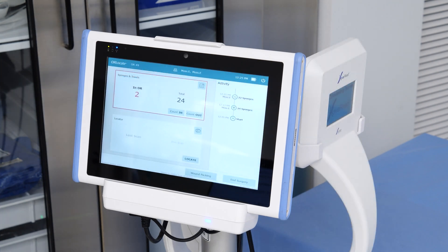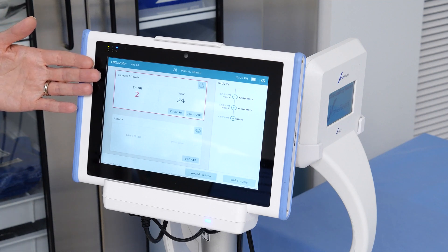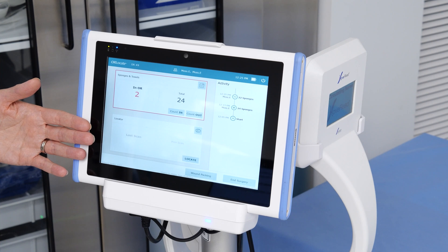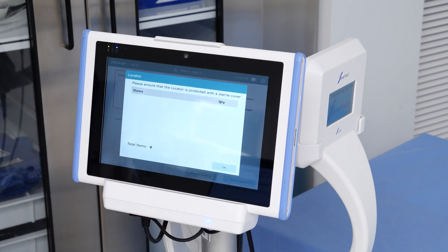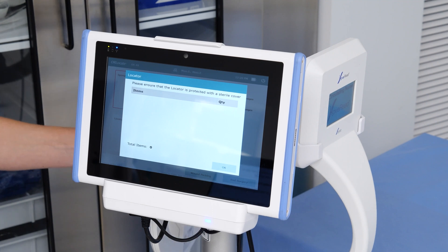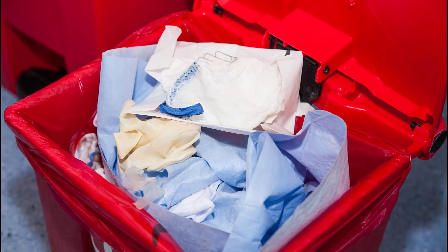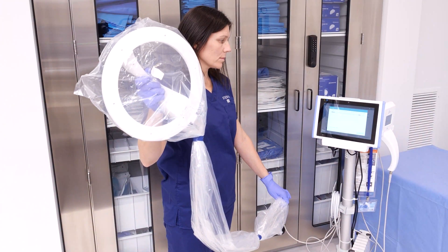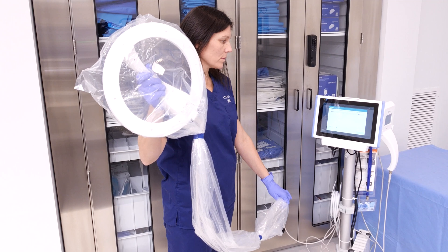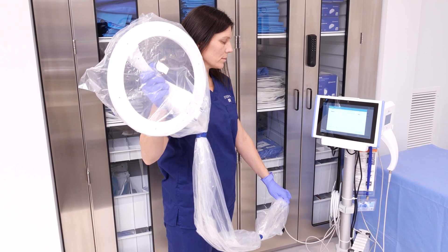In the event that you have a missing sponge, as shown on the screen, the locator will need to be used to determine the location of the missing sponges. Press the locator button in the lower window to turn on the locator wand. Remove the locator and look for the missing sponge by waving over the trash, linens, or patient. When using the locator in the sterile field, the sterile drape will need to be applied over the locator and cord to protect the sterile field.